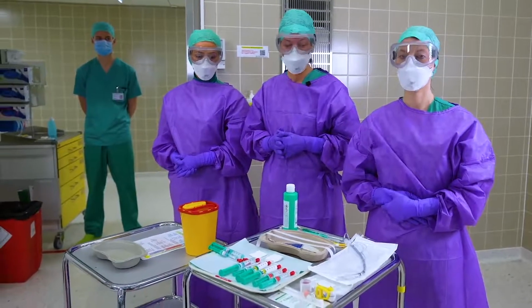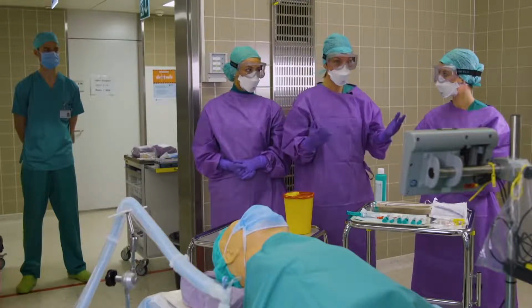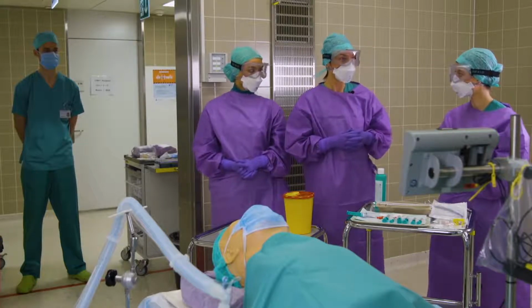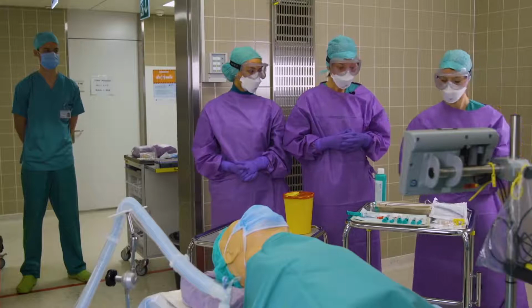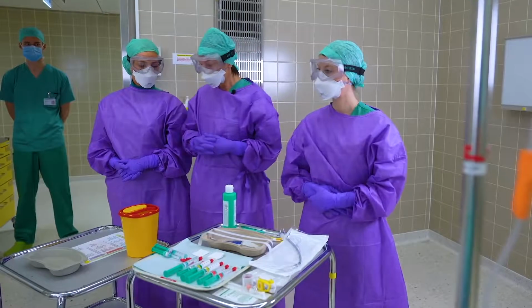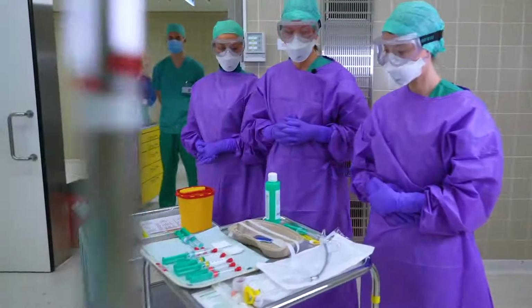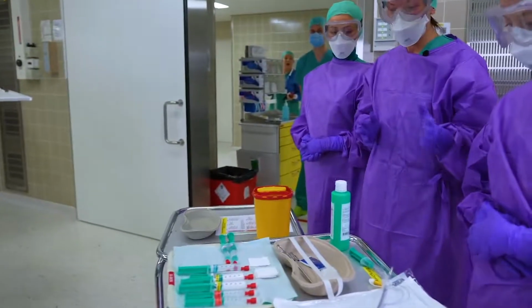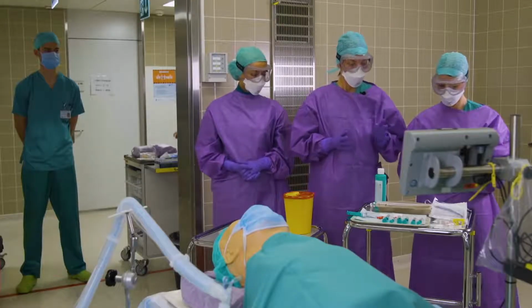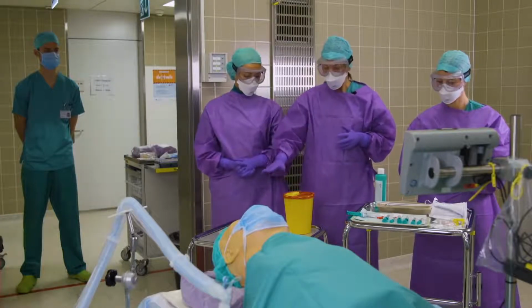First, we have the planning, and as you can see, we are all donned in protective gear, which is according to your local SOPs. We did our body check and we deemed each other appropriate for this procedure. For induction, we have our medications on the tray, as well as our airway materials, including an endotracheal tube with a stylet in place, as well as our video laryngoscope. Next to the induction table, we have our dirty tray for dirty materials to be disposed there.